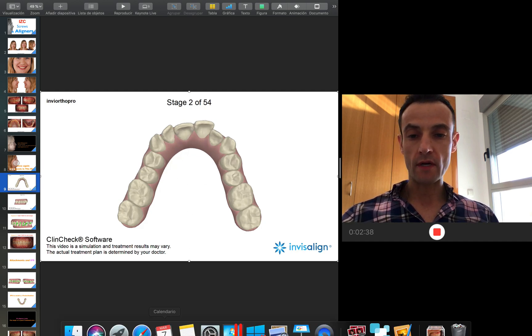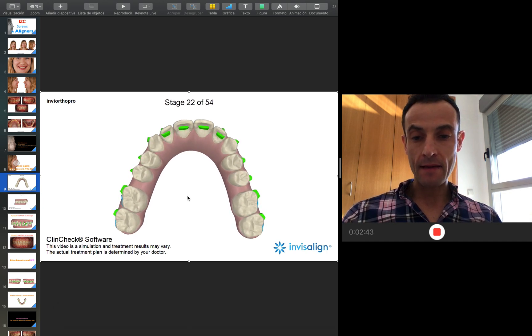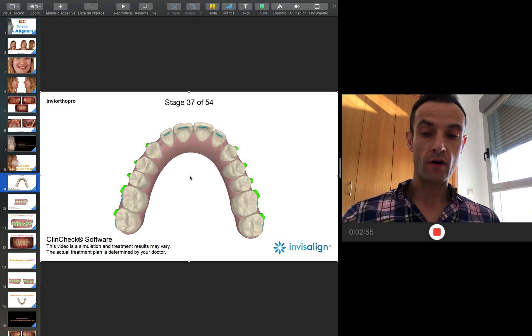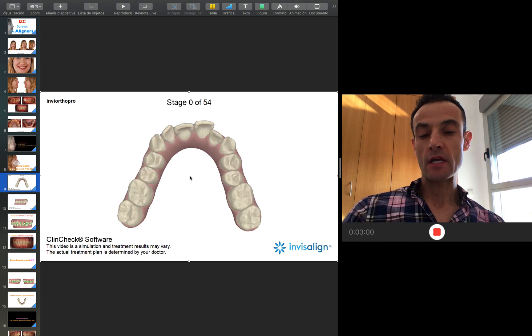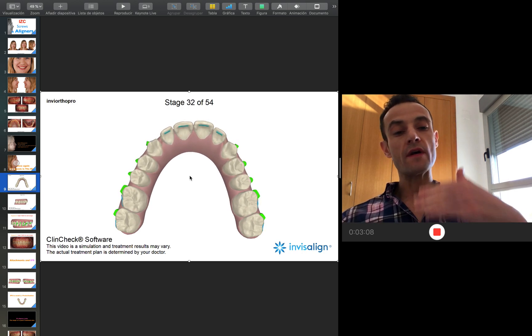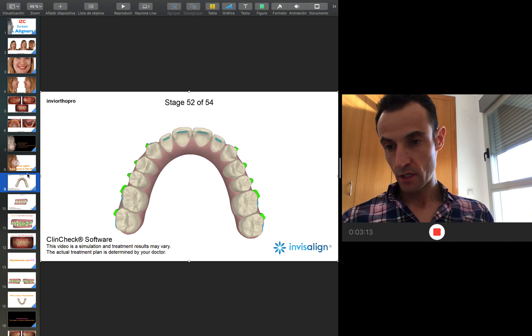The case I'm going to do — as you can see here — I'm going to do the upper molar distalization protocol, but with a modification: I'm moving the molars to distal, I develop the rest of the arch, and in this situation I'm going to retract from 5 to 5. So I'm not doing a pure distalization protocol — I'm going to use mini screws. First, I distalize the second and first molar to Class 1, and then from 5 to 5, doing intrusions, retrusions, and eliminating the palatal attachments.